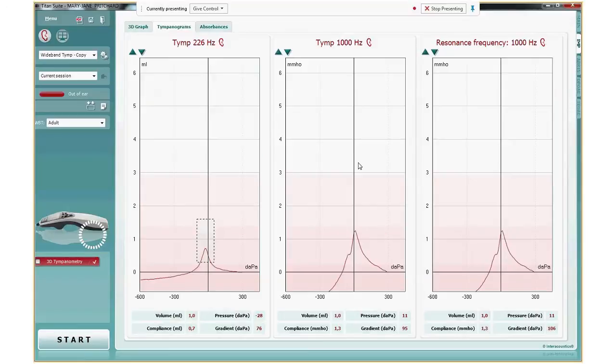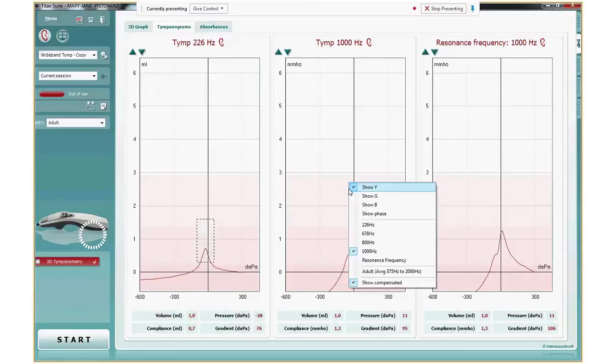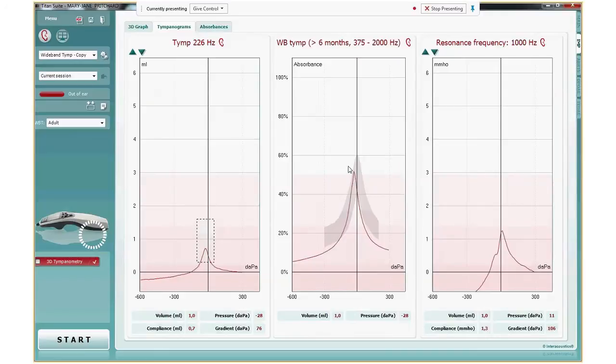What we can also show is a new type of tympanogram. I right mouse click on the middle graph. And then I select the adult, the average between 375 up to 2,000 hertz. And here we see a wideband averaged tympanogram. To explain what a wideband averaged tympanogram is, I need to switch back to my presentation.